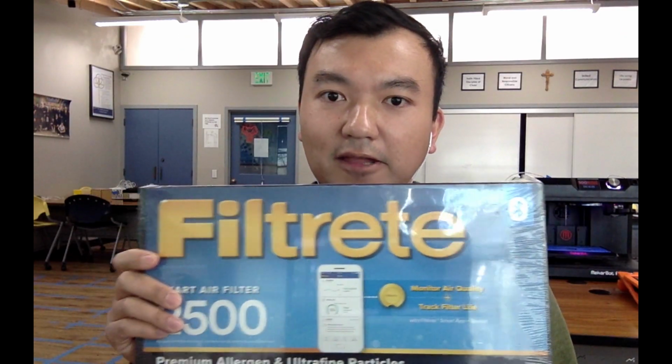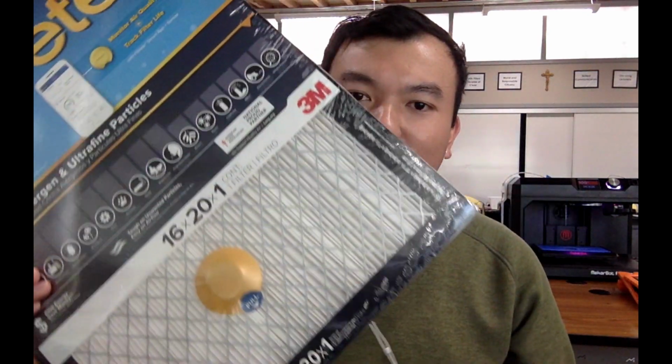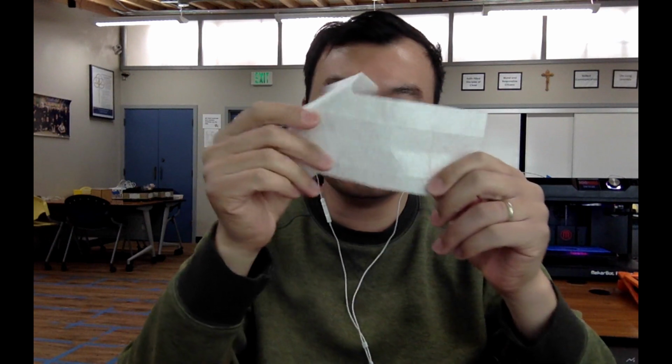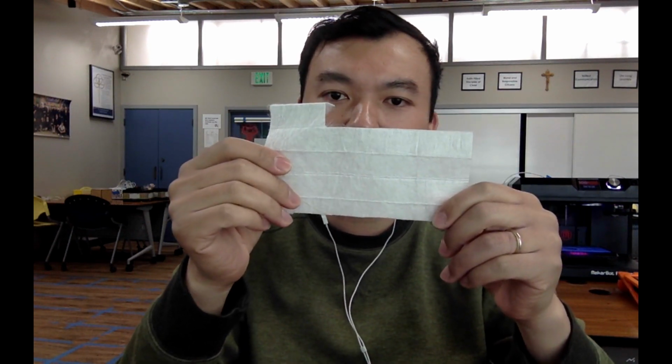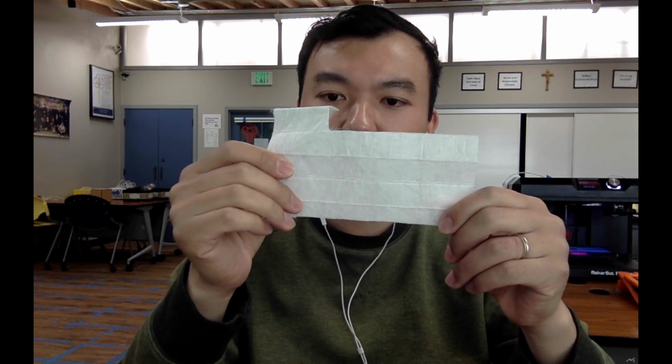All right. On another note, you got to take off the filter packaging. So there are metal rails right here, as you can see. You got to take that off and turn it into a sheet like this. Big. It's really, really big. Okay. Cut it up so that way you have a smaller sheet like this, so that way later on you can cut into squares to put into your face mask. Okay. So here we go. Let's go to our station to start assembling our face mask.